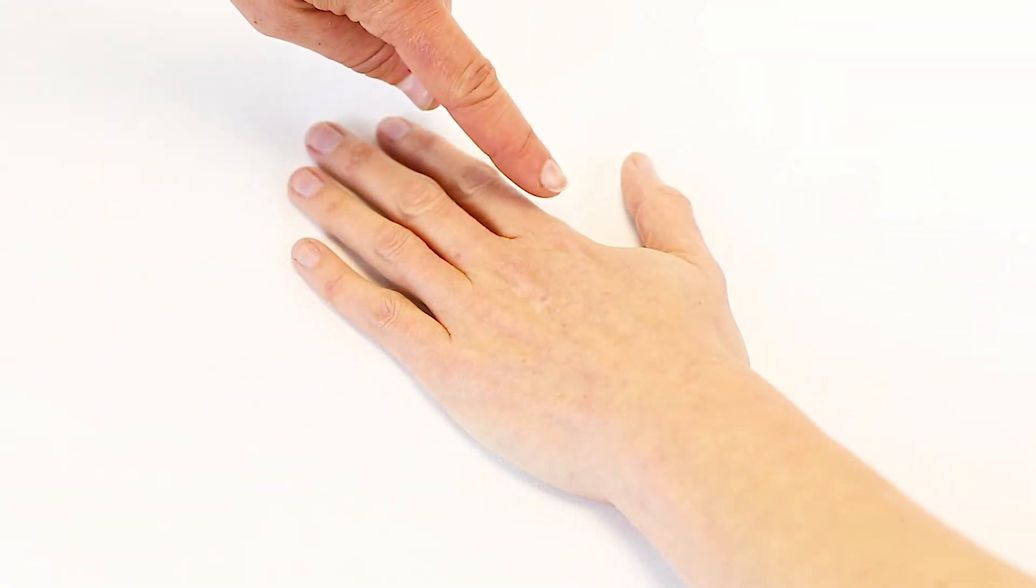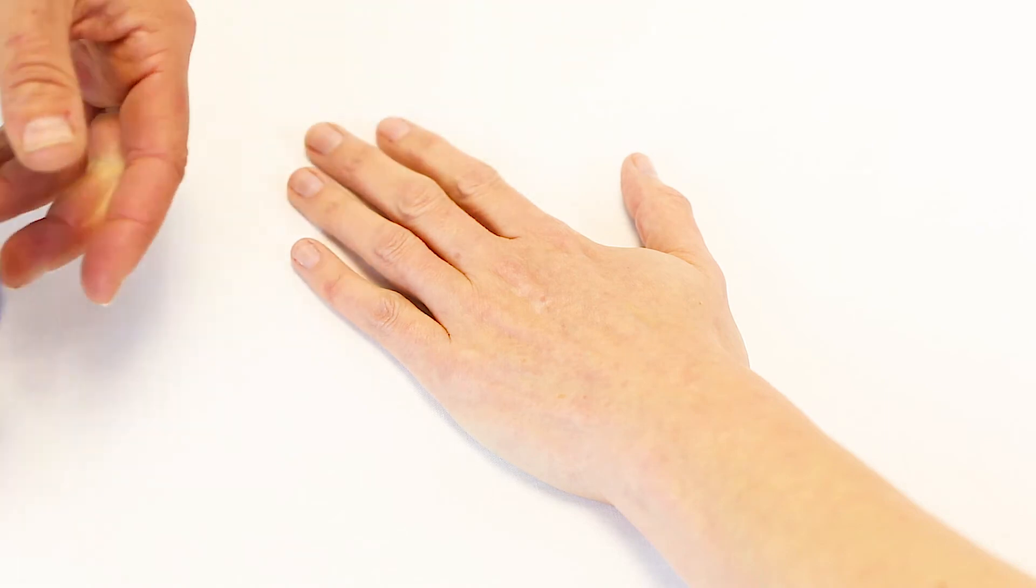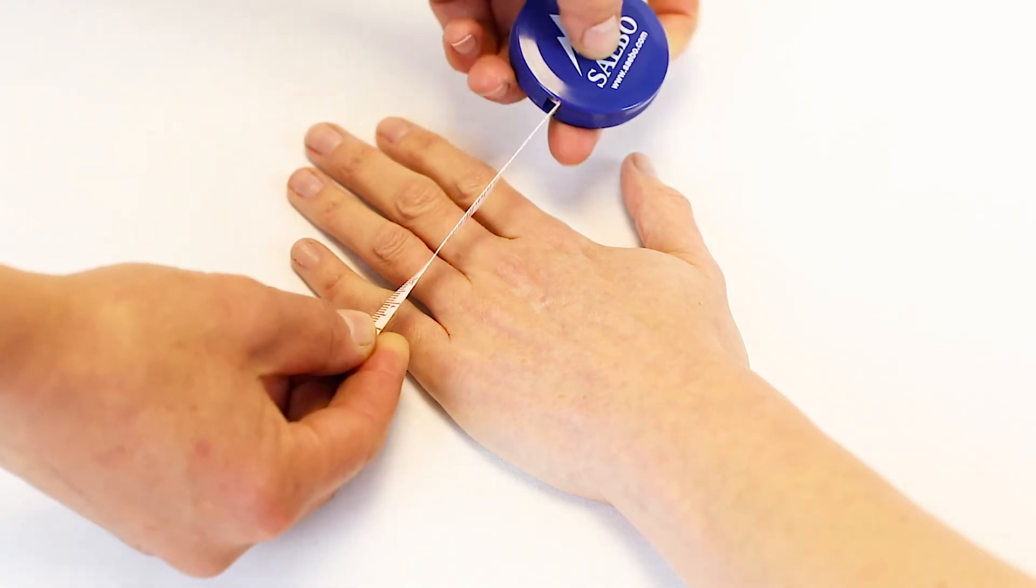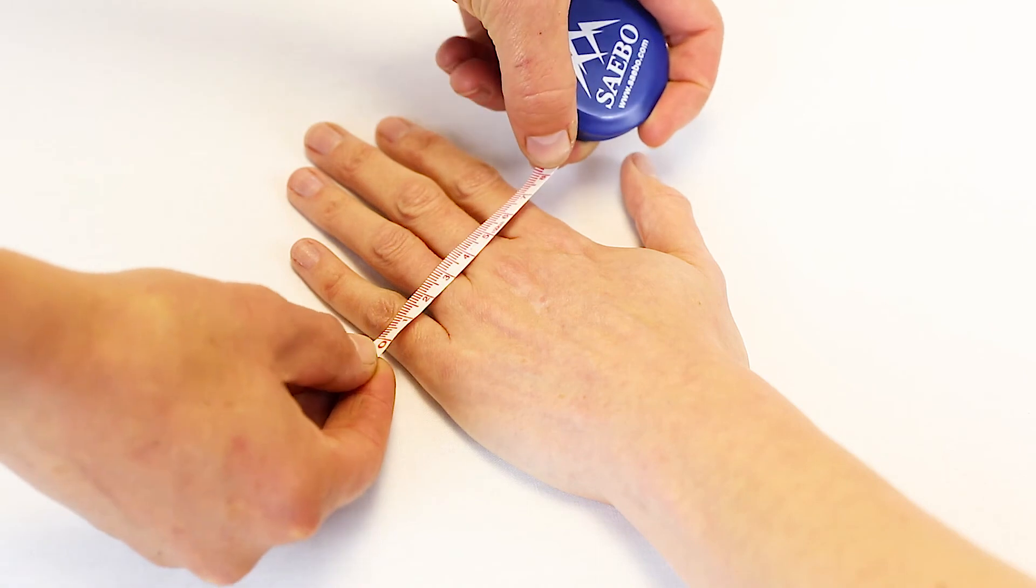Take a horizontal measurement across the hand just past the knuckle joints indicated by where my thumb is. The tape measure should not wrap around either side of the hand.